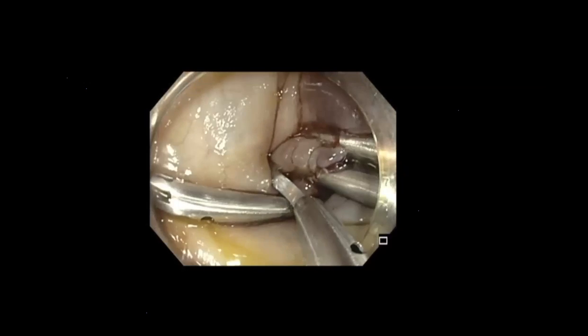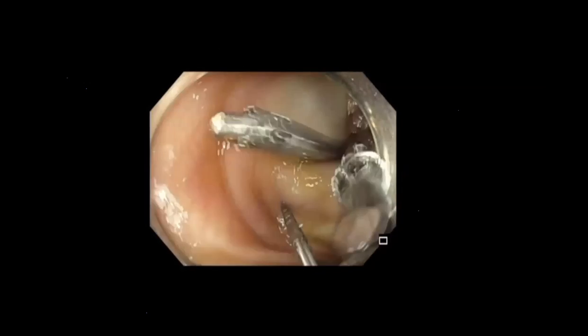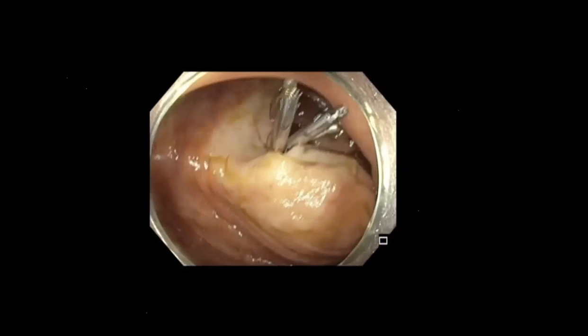The other thing you have to keep in mind is when you are doing a colonoscopy and you go through multiple loops and you reduce multiple loops, when you are coming back, you have to think that those loops are going to form and it's going to be a closed loop. And any amount of distension that you create can cause unnecessary problems to the patient.